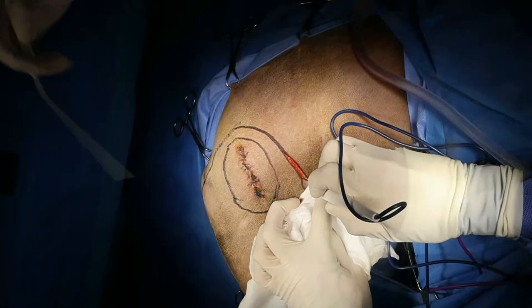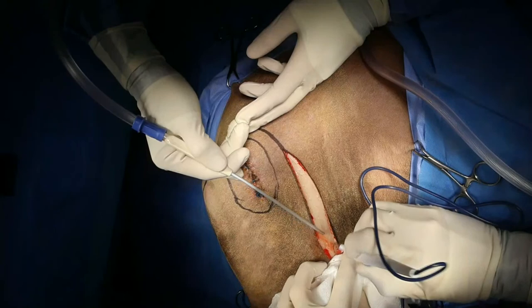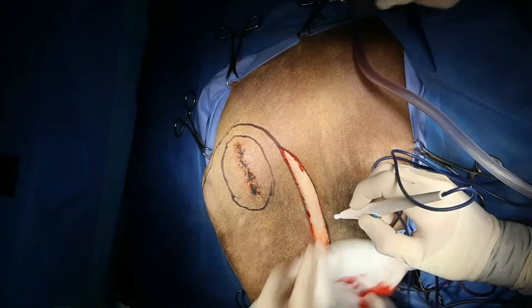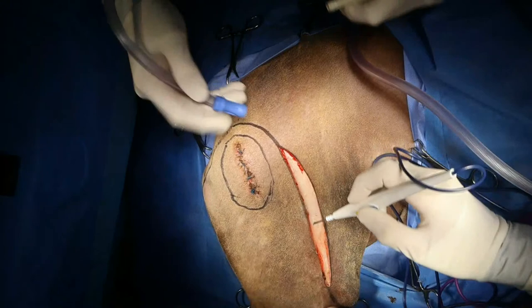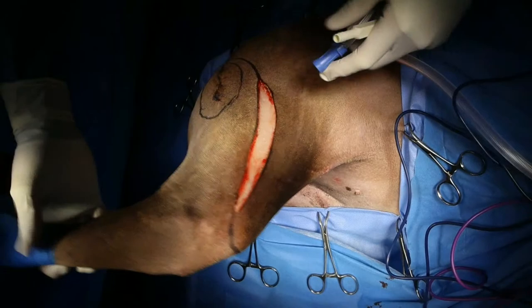I have to stay fairly superficial here because the tumor is not that far beneath the skin in this area. So I'm just cutting through a vessel that's commonly used for an axial pattern flap in this area. Anybody know what that is? It's a suction. So I'm about to cut through a vessel that comes up right through here. That's used for an axial pattern flap, and just wondering if anybody would know what that is. I know, it's hard.